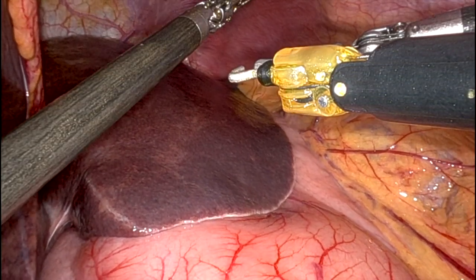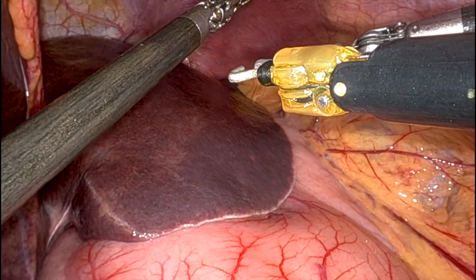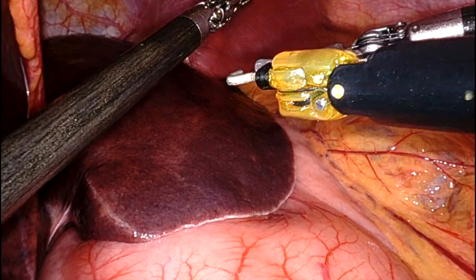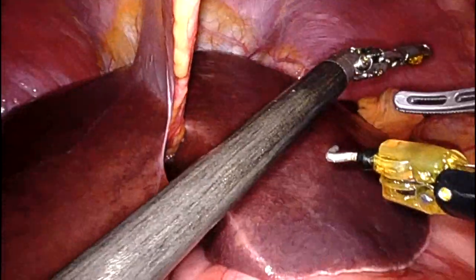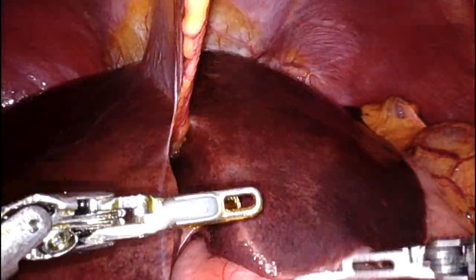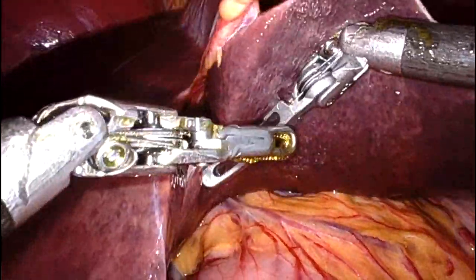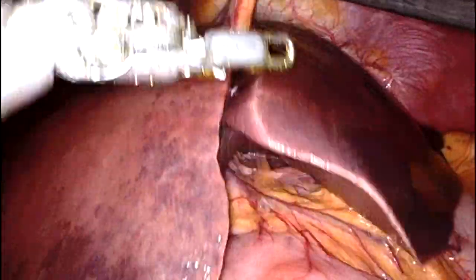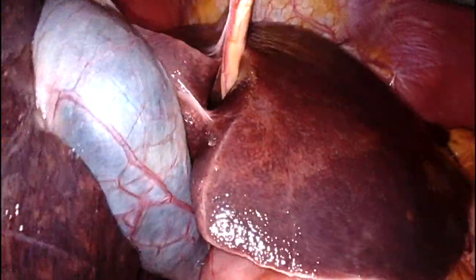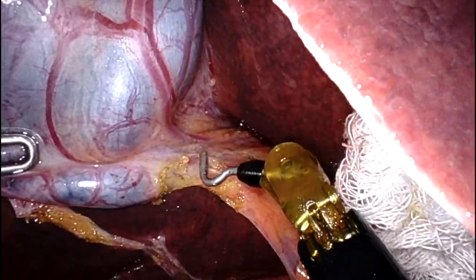This is intraoperative. The liver definitely looked like chemo liver, although she only had four cycles of chemotherapy. You can see the tiny tumor there in the left lateral segment. The liver definitely looked uglier than what I was hoping for.